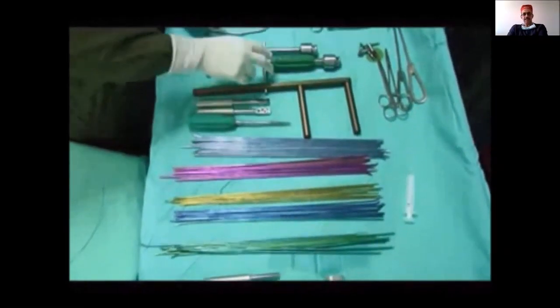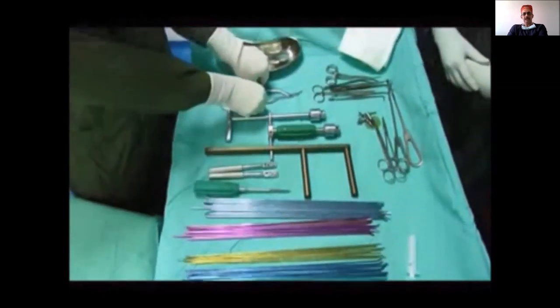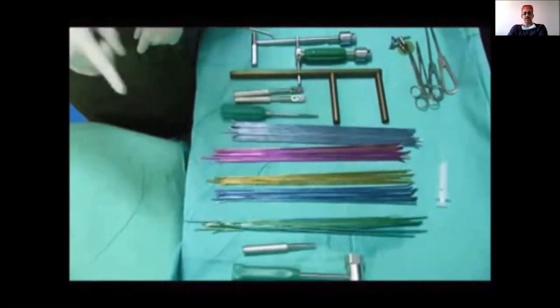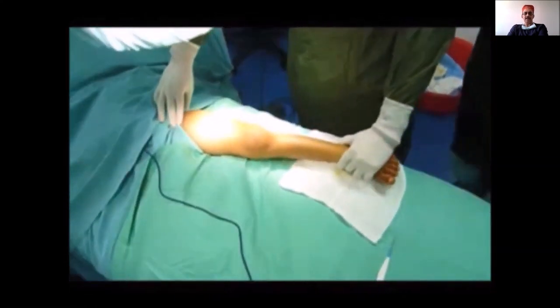The instruments include the awls, the bending tools, the F-tool, the chuck on the T-handle, the straight and curved awls, a slotted hammer for insertion and extraction, and the seating tool. The first step is to align the fracture by linear traction, and then you must choose your nail.